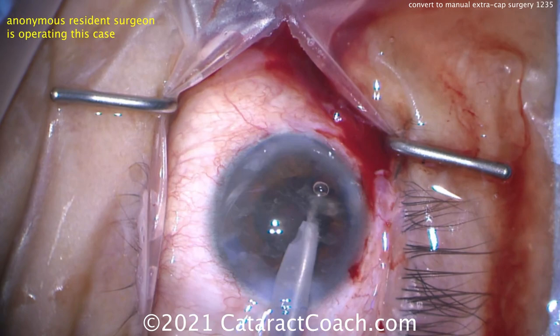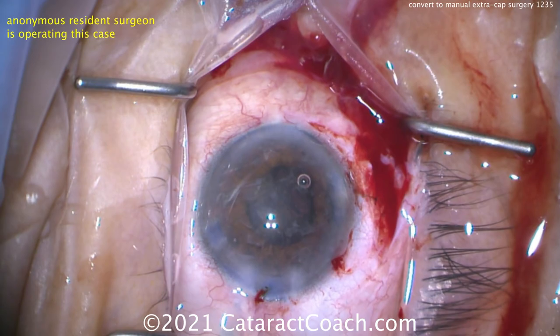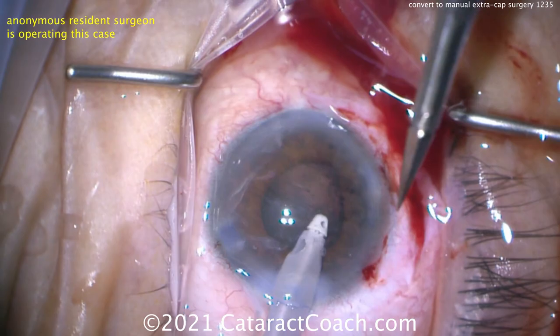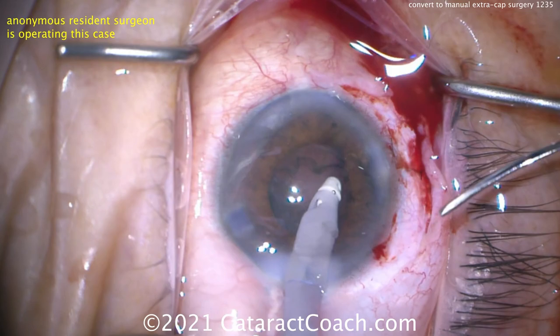These are softer epinuclear shell pieces — there's really no nucleus left. Be careful of vitreous prolapse. Using the IA probe to clean up any remaining lens material. The key here, if you use an IA probe, is to listen for the ding-ding-ding sound — on most machines that's the sound of occlusion, meaning the probe is being occluded with lens material. There for sure you can see there's a break in the capsule.